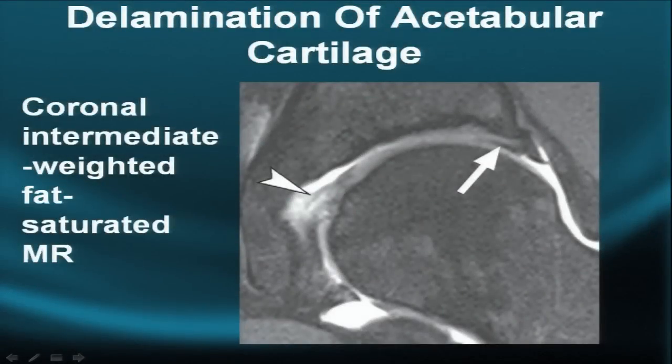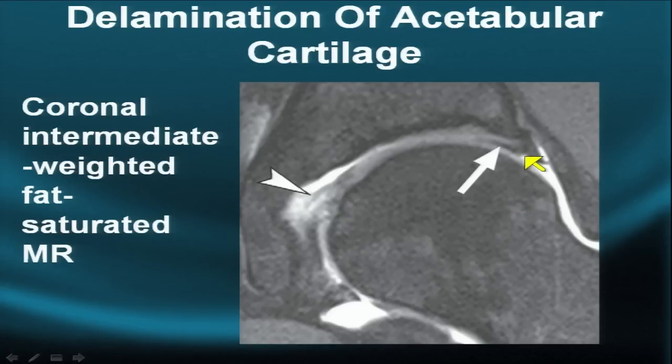Welcome to the Pomerantz mentor series. Today's vignette will continue the summation of MR of the hip with some anatomic variations. We begin with a coronal intermediate water-weighted sequence with fat suppression, giving us an arthrographic effect and showing the superior and inferior labrum, with a little fraying of the ligamentum teres.